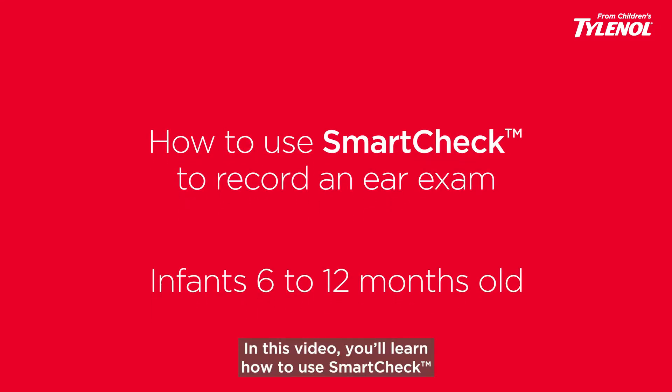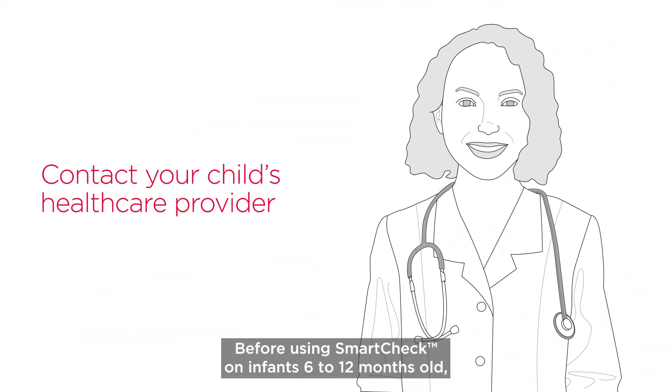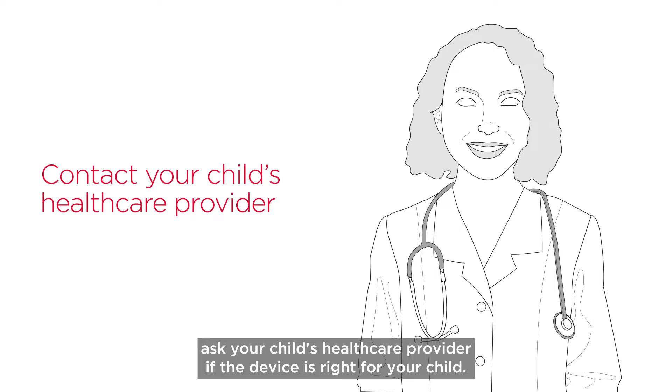In this video, you'll learn how to use SmartCheck to record an ear exam on babies 6 to 12 months old. Before using SmartCheck on infants 6 to 12 months old, ask your child's healthcare provider if the device is right for your child.